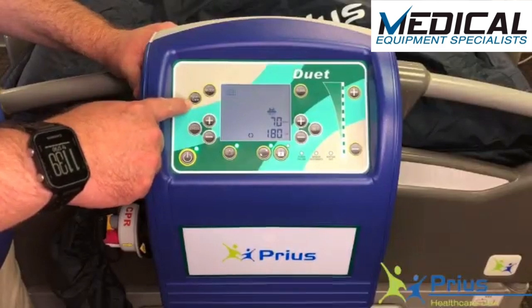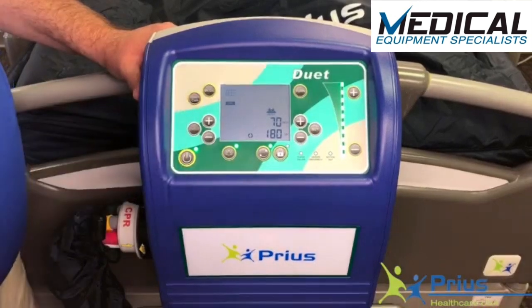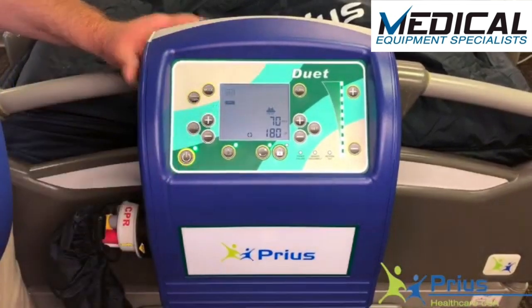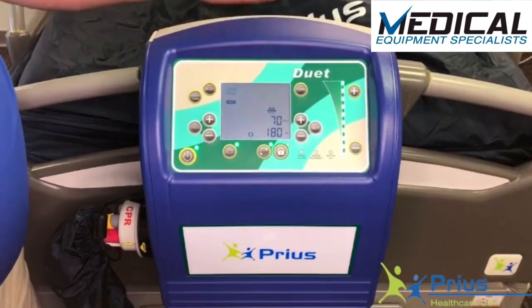For ingress and egress, the patient care button is on the left-hand side of the control panel. When I engage that, the max light comes on and the mattress raises all the way up to its firmness to make it easier to get the patient in and out of bed.